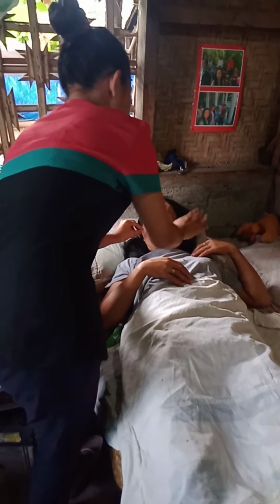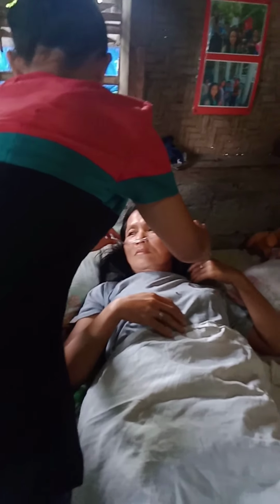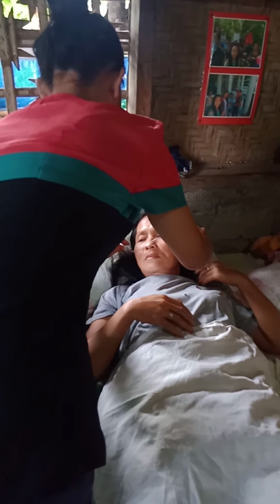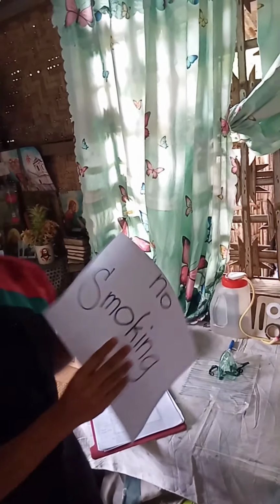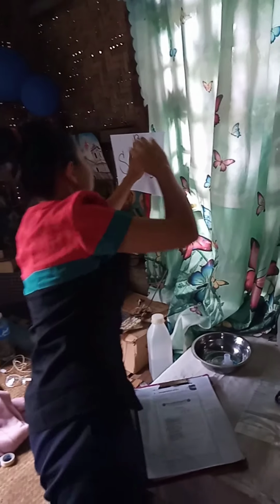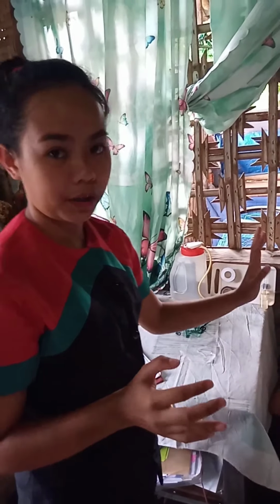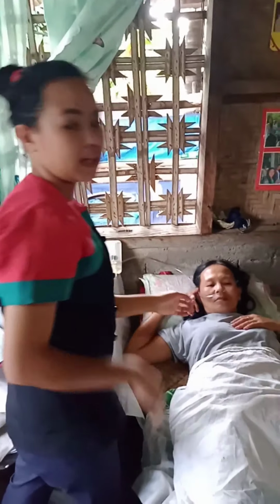Then secure this cannula over the patient's ears. Then after that, position the oxygen delivery equipment appropriately. Then it is very important to put a no smoking sign on the patient's door in view of the patient's visitors. Then after that, it is very important to check the flow rate every 4 hours. Then assess your patient's nostrils every 8 hours.